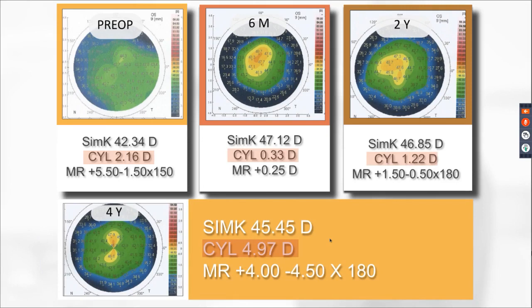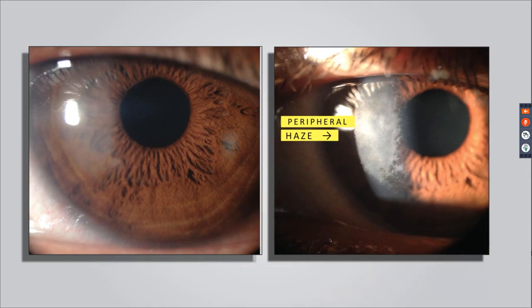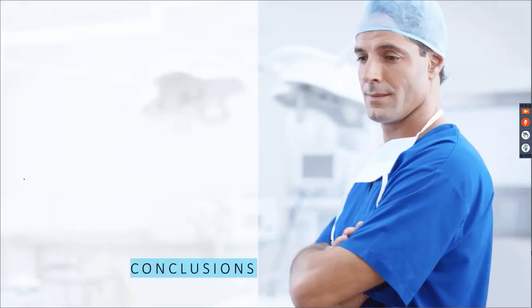And interestingly, this is the slit lamp exam. We see a Salzmann-like haze nasally. This is nasal, and typically causes a flattening horizontally and a steepening vertically. So again, with smart surface, and maybe more mitomycin C, but more importantly with smart surface, the keratocyte activation would be much less, and the chance for haze, but more importantly for the astigmatic scatter we get, is much less, let alone the spherical equivalent scatter.